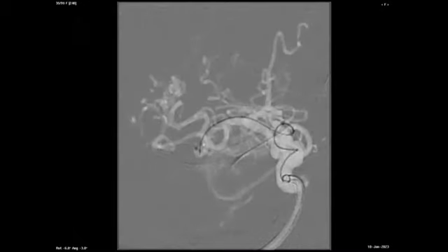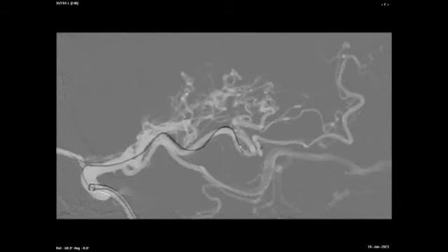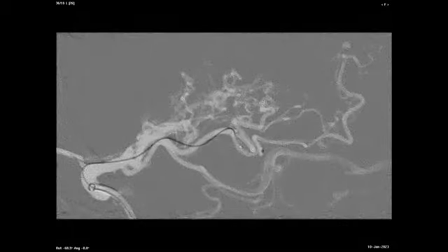In the other angle, the AP angle, slowly with the wire, we massage the microcatheter to make it move ahead slowly through the loops. And then we even changed the wire, gave it a different shape, and slowly straightened this loop so as to cross with the microcatheter.